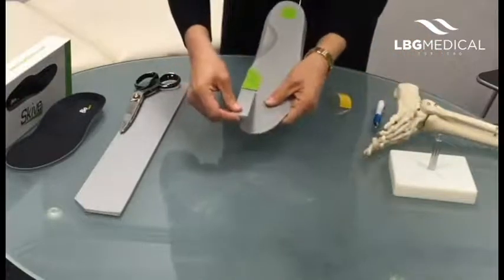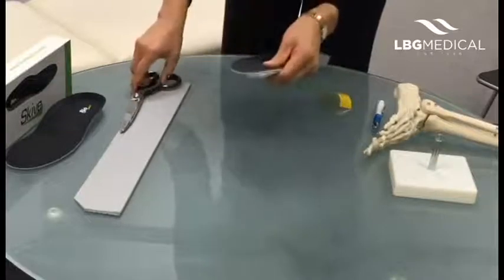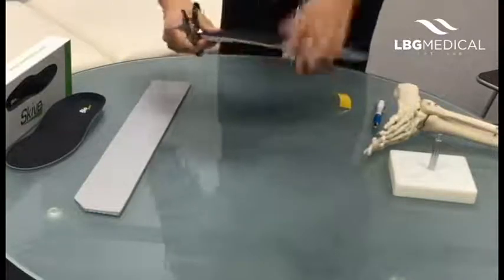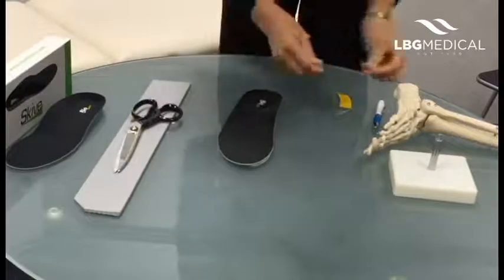We just stick it on — again, with the thick end on the distal bit, which is why it's called a distal hallux post. Trim that off. Do use sharp scissors as well, because that will save your wrists in the long run.